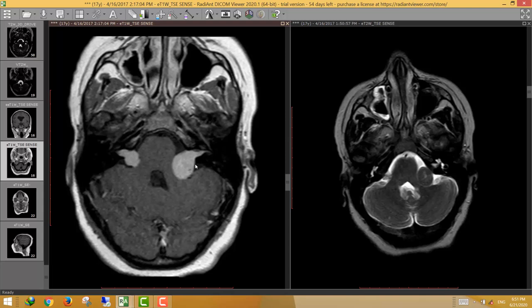This is bilateral schwannoma, especially as there is no dural tail, excluding meningioma. So this is a bilateral cerebellopontine angle schwannoma. As a general rule, bilateral cerebellopontine angle schwannoma indicates the patient has neurofibromatosis type 2.